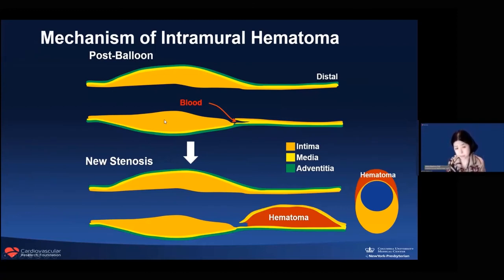And once the lesion segment was ballooned, at the edge, medial dissection, because those segments were relatively normal, and they extend very easily distally and making the closed space without re-entry site, and blood going to be here and making the hematoma and pushing to the lumen.